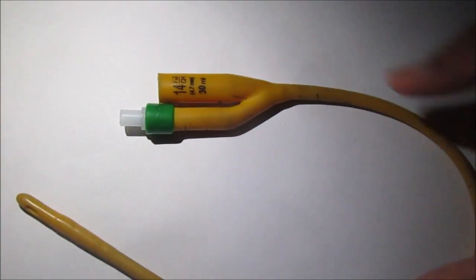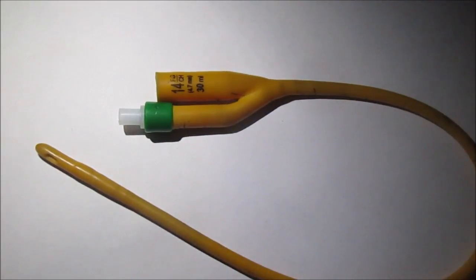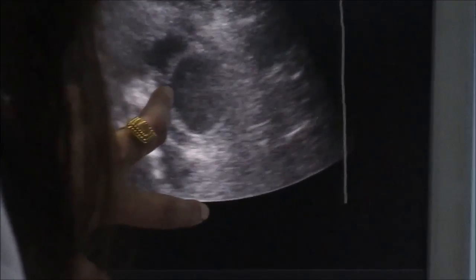If the valve is blocked, then what to do? Here are the options. Here you can see an ultrasound guided puncturing of the balloon of the catheter.